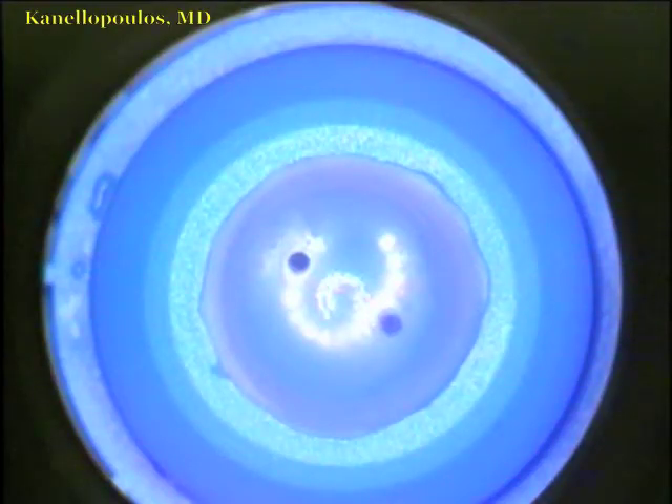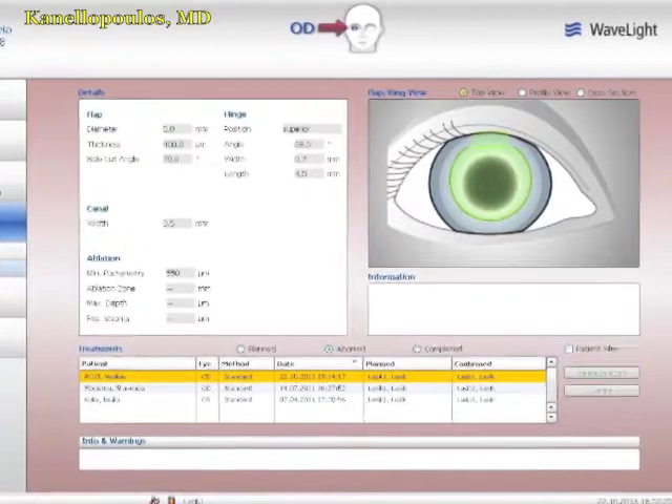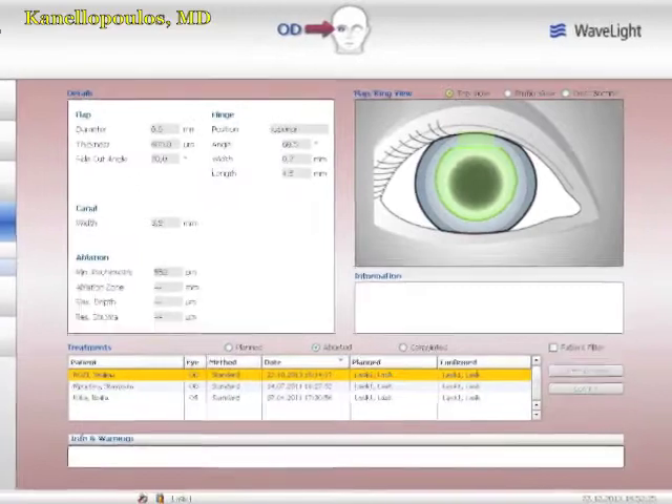You'll see here the donor cornea on a single-use artificial chamber. We use the FS200 Wavelight Alcon femtosecond laser. You can see the settings here. We're going to do a pocket — 8mm diameter at 400 microns depth. These are the femtosecond laser settings.